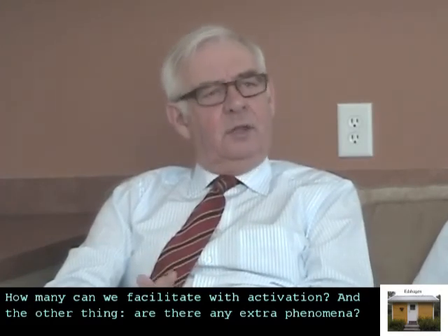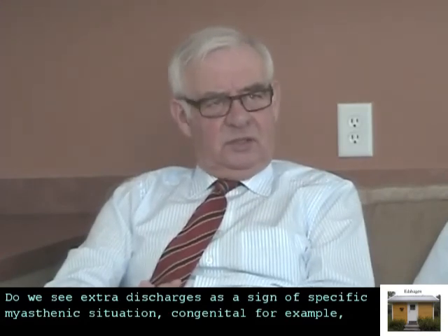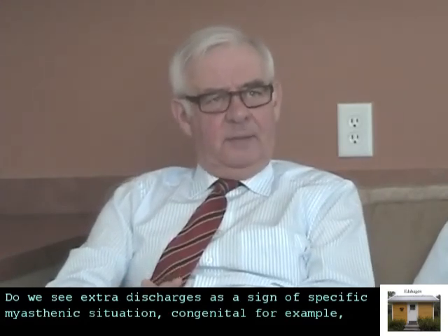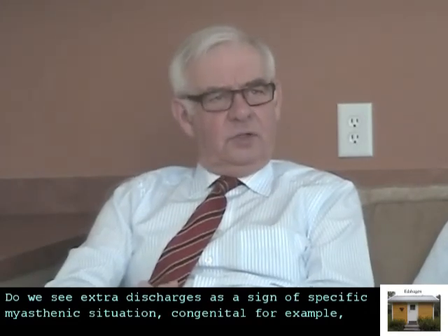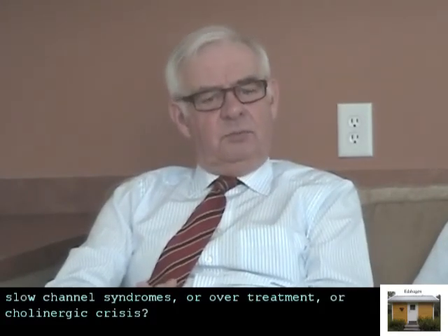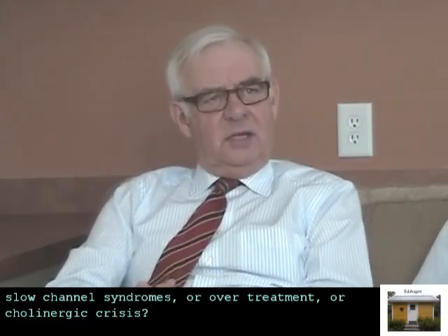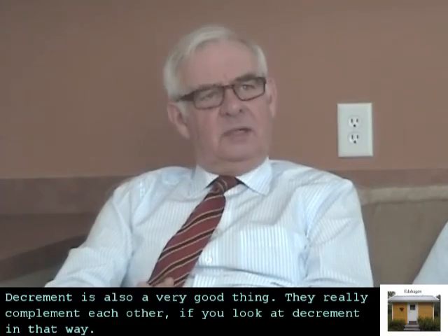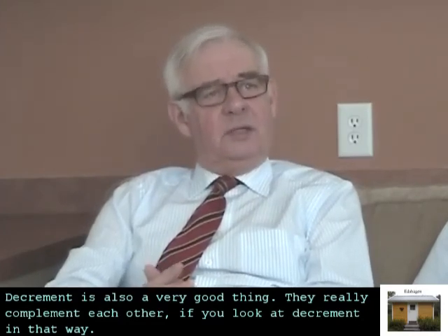And the other thing, are there any extra phenomena? Do we see extra discharges as a sign of a specific myasthenic situation, congenital, for example, slow channel syndromes, or overtreatment, or cholinergic crisis, and so on. So decrement is also a very good thing. They really complement each other if we look at decrement in that way.